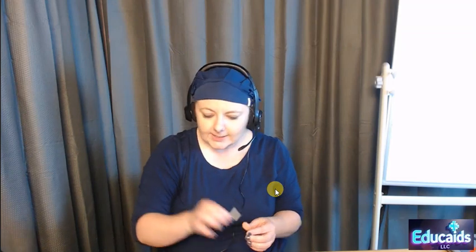Got my blood sugar. And remember, your normal blood sugar is 70 to 110. Okay? 70 to 110. Usually in the hospital, we start to treat them with sliding scale insulin if it's above 150. That's most hospitals. All right, and so then I would dispose of this properly, and I would dispose of my lancet.